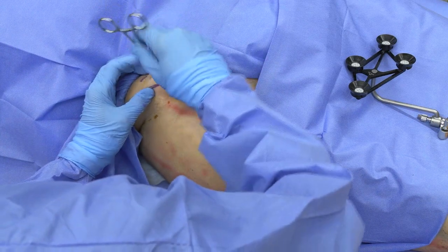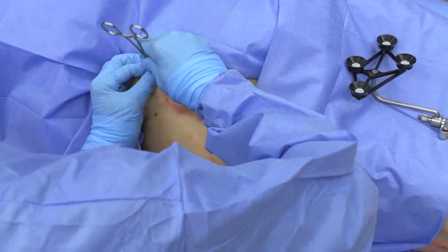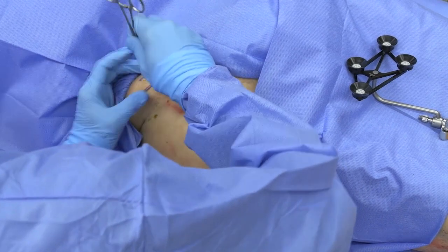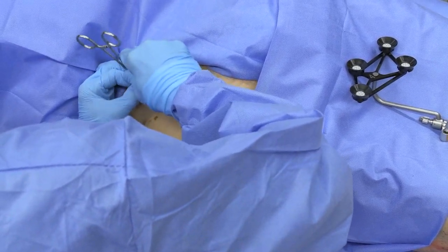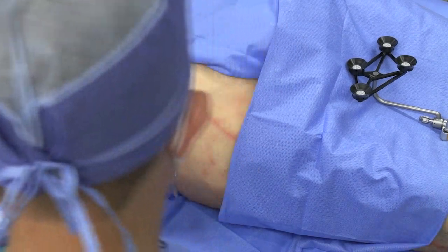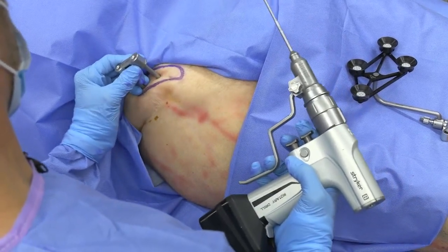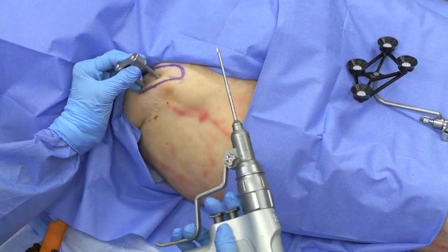Next step is the hemostat. We want to clear off periosteum and be able to palpate the inner and the outer tables of the pelvis. Once we have that, we can position our pin clamp right in the center of the iliac crest.